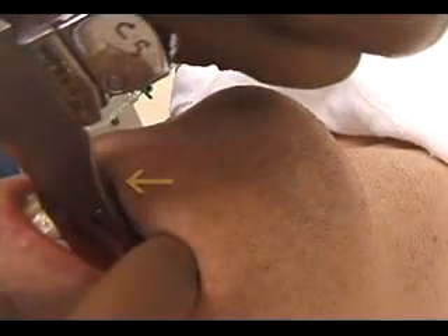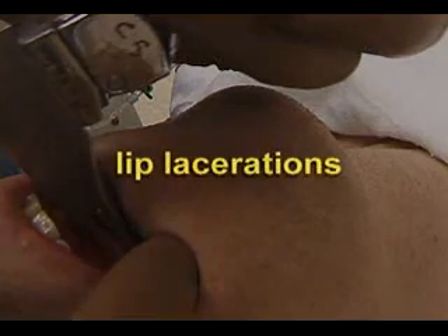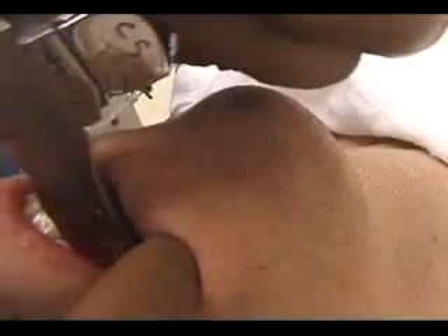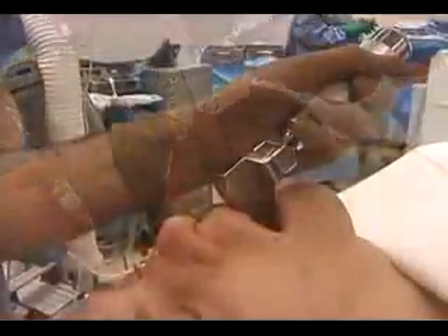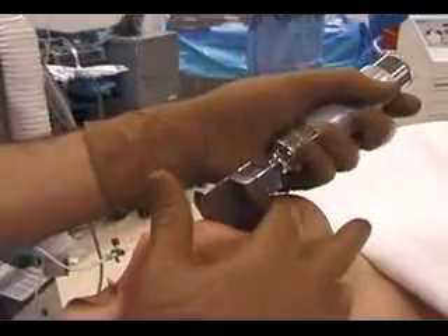Not uncommonly, the lower lip is dragged into the mouth and compressed between the laryngoscope blade and the lower incisors. This can cause deep lip lacerations which may lead to bleeding and airway management complications. To minimize this risk, the laryngoscopist should always investigate if the lips are cut against the teeth by sweeping them with his or her fingers, as shown here.